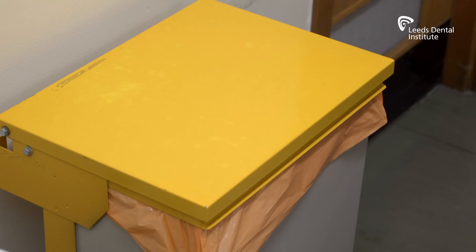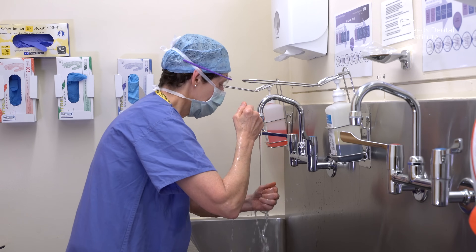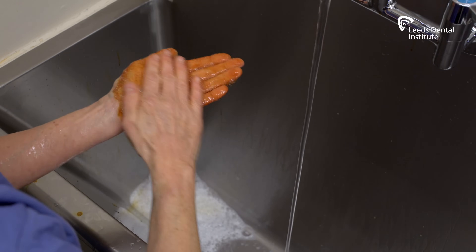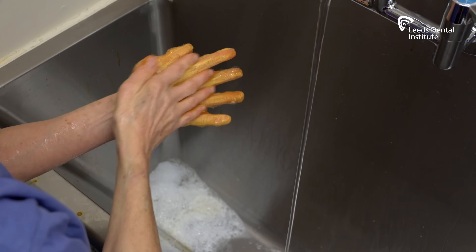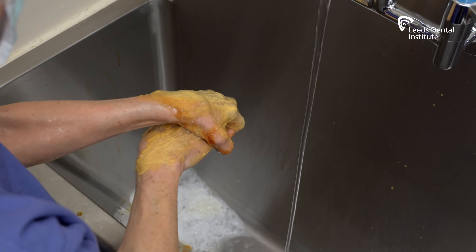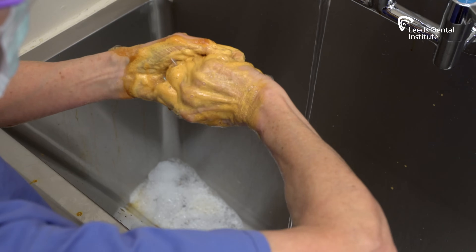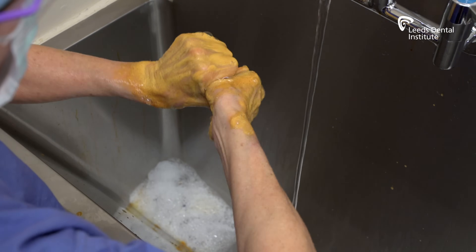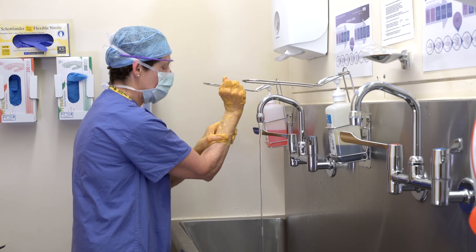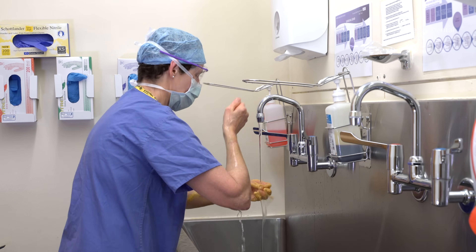Dispose of the brush, then rinse your fingertips. Apply another 5ml of solution. Wash your hands and arms using the seven-step method, paying particular attention to palms, finger webs and dorsum of the hands. This time, only wash the first two-thirds of the forearms and do not touch the elbows to avoid contamination. Wash for a further minute. Then rinse your hands and arms from the fingertips to the elbows, allowing the water flow to remove the scrub solution.